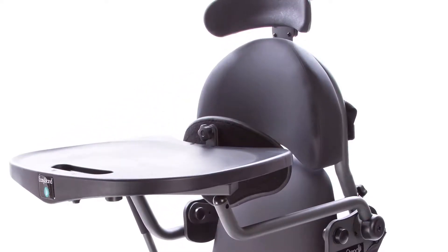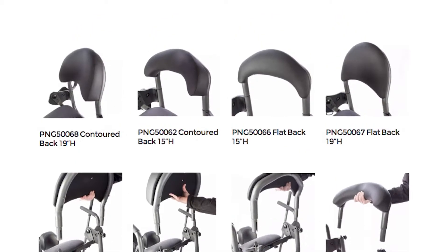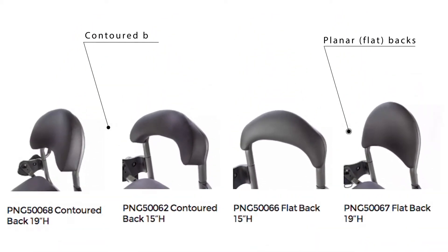The Easy Stand Evolve has several backs to choose from. You can get a 15-inch back or a 19-inch back in either planar or contoured profile.